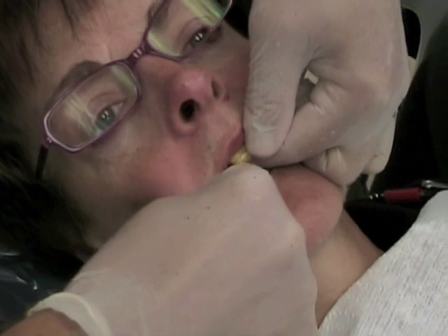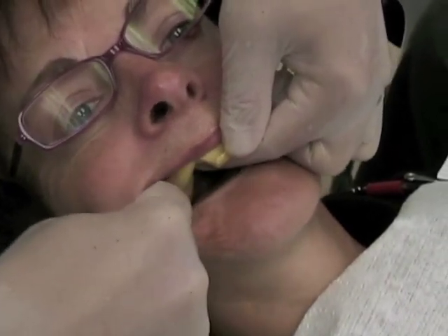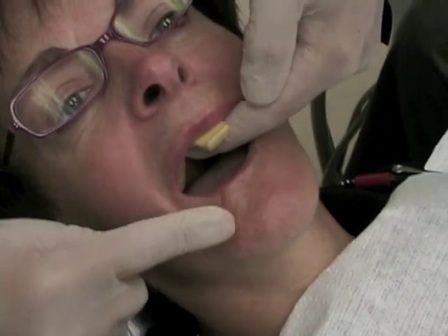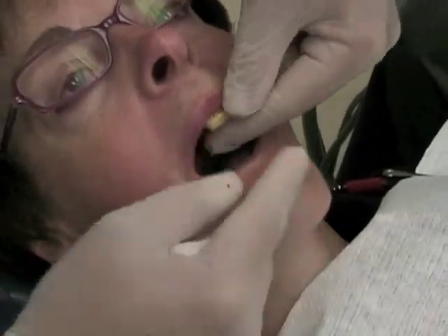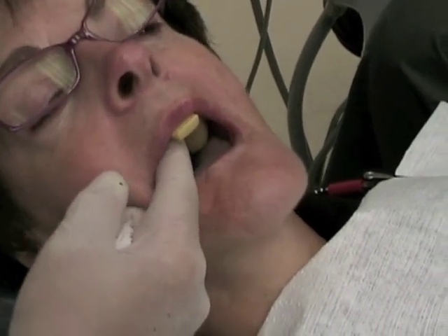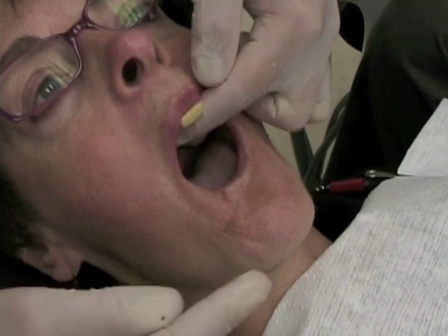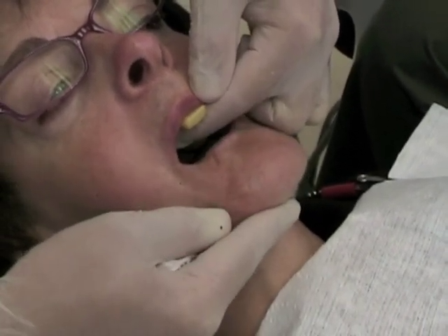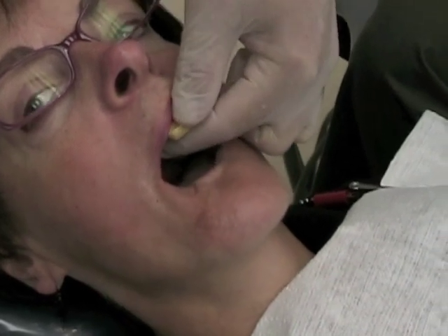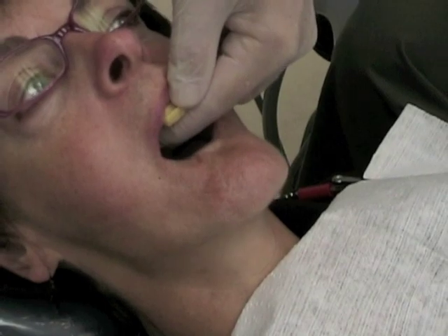For review, when molding on the buccal and posterior borders: pull the cheek downward, outwards, using circular motions. Have the patient move from side to side, have their chin move from side to side, and have them open very wide. These movements will affect the border of the compound and mold it. Here the patient is opening and moving from side to side to contour the distal buccal aspects of the softened compound.